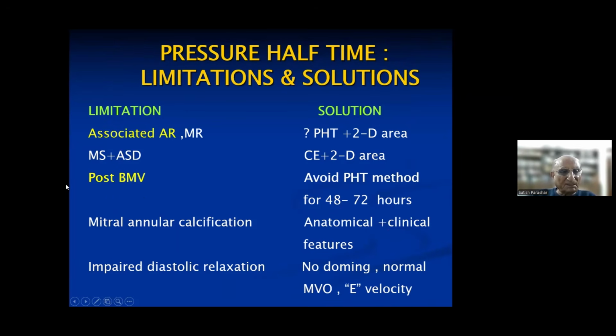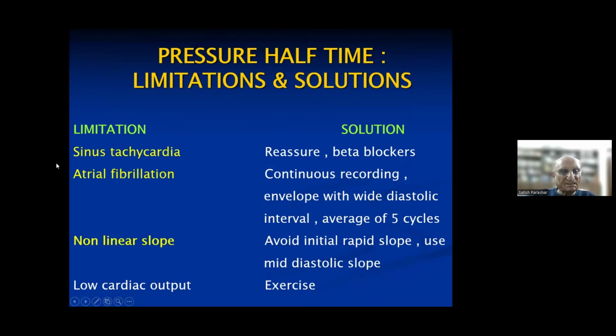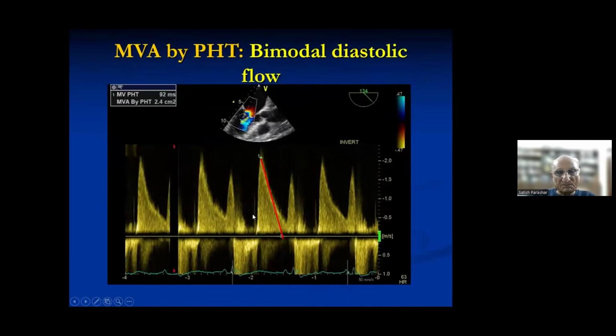Only remember that when a patient has undergone a balloon mitral valvotomy, they immediately send you to determine the mitral valve area. Always take a planimetered mitral area, not the pressure half time. So these things are too much for you, but remember, these three are extremely important. These are the problems which we face in our daily life, and we do not get many other problems.